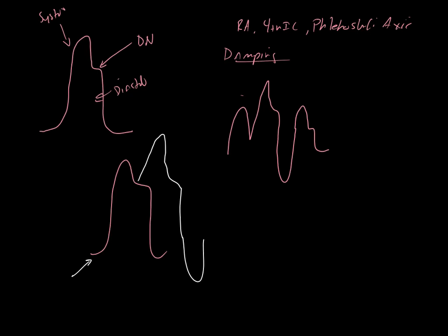Okay, so this is an unaugmented beat, and then this is an augmented beat. All right, so this is a dichrotic notch. You guys good with that? And you see how it inflated on the dichrotic notch there? Pressure went up, and then it deflates prior to the onset of systole, and it kind of has this U shape to it, and the pressure goes below the baseline. Those are all things that tell us that we have good timing.